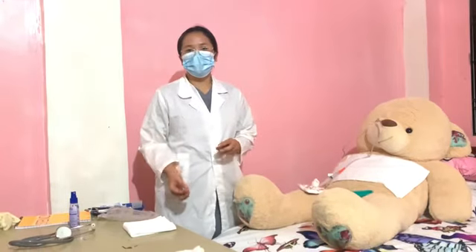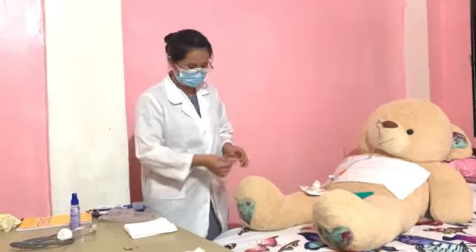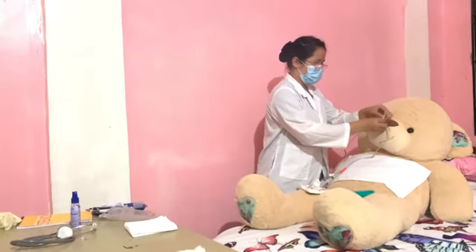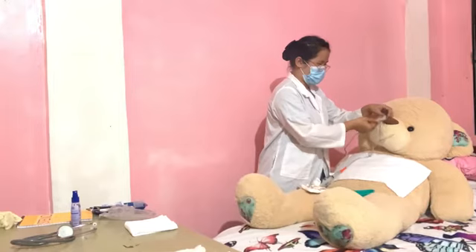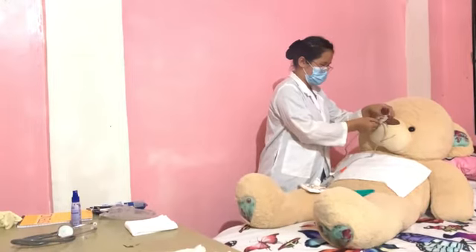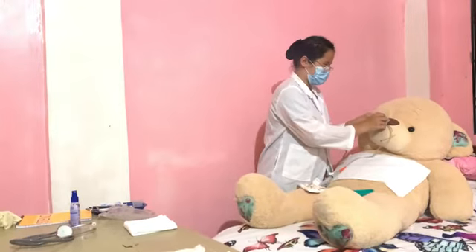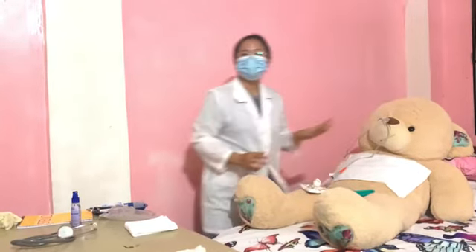Remove gloves and secure the tube with a commercially prepared device, following the manufacturer's instructions, or tape to the patient's nose. Open another glove and clamp the tube and remove the syringe, cap the tube or attach the tube to suction.